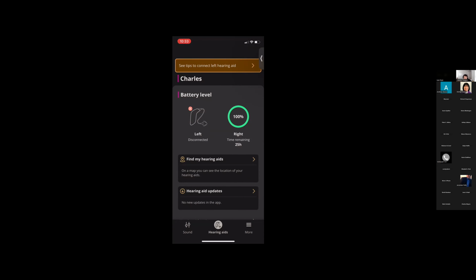This amount is not entirely accurate. The reason for that is because when we use our hearing aids to connect to certain things, we are asking it to do more than just listen with the microphones on our hearing aids. And that takes a little bit more out of the battery. I find that you get about 10 hours, and then if you shut them off, you can get about another 8 hours when I use them regularly.